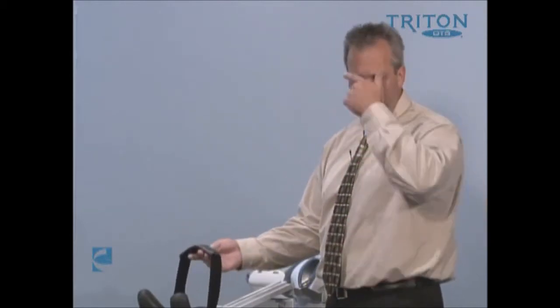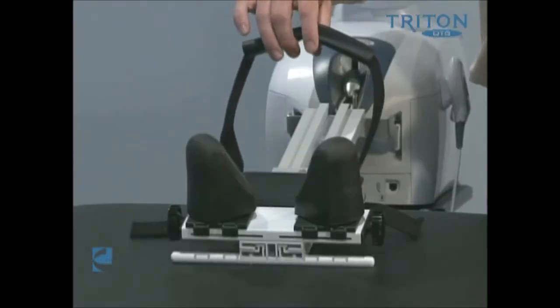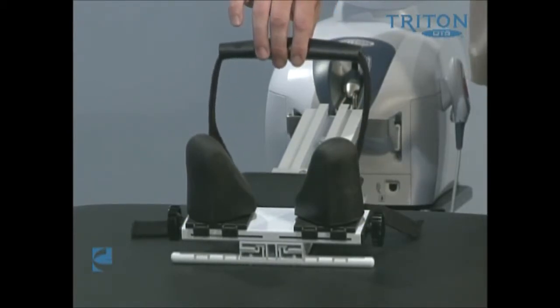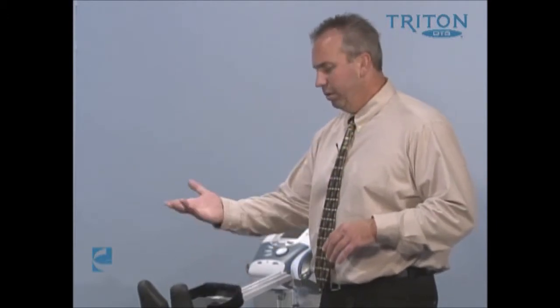We also have a forehead strap here that's going to go across the cranium. That's just to make sure that we keep people in a down position, so it doesn't have to be excessively tight. We don't have to worry about putting it on so tight that it pulls their neck into extension. We just want to make sure that they can't move from that position.